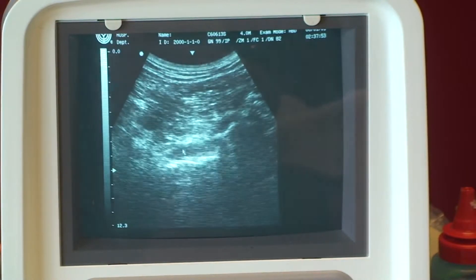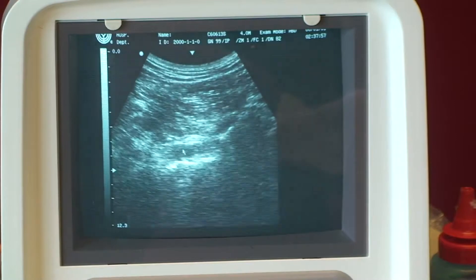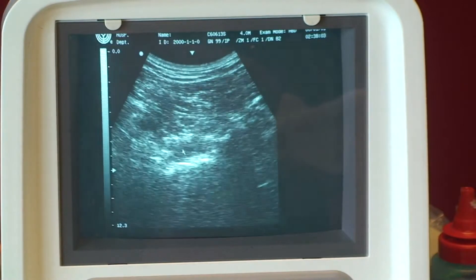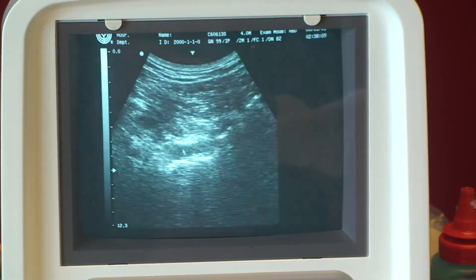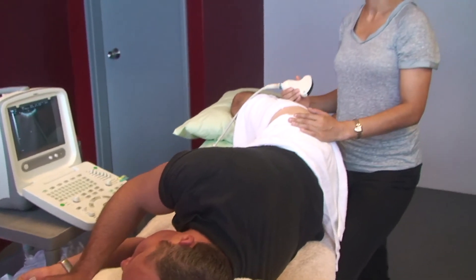We'll do that one more time. Very gently — gently shorten the femur, gentle heel squeeze, and think about just lifting the top of the leg — and then relax. Very good. We just had an excellent contraction of the quadratus femoris.